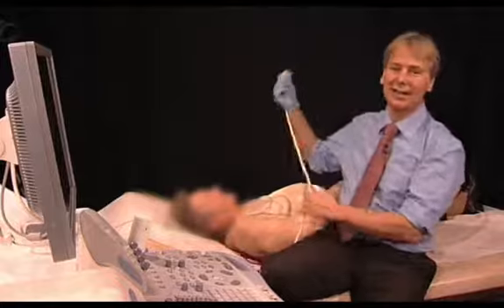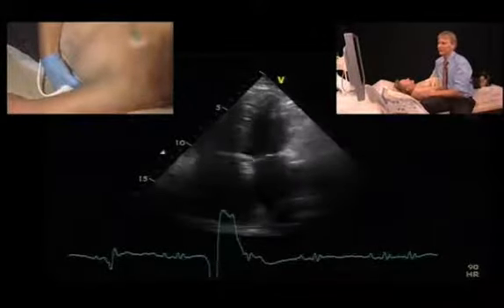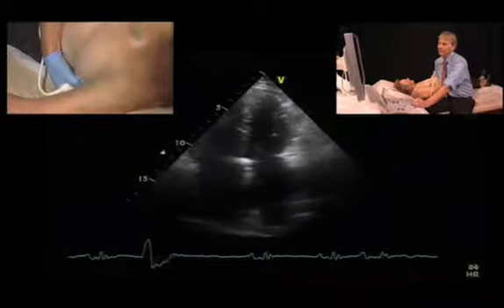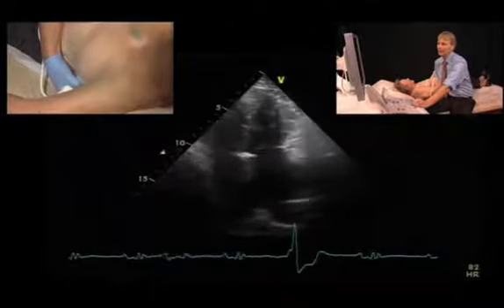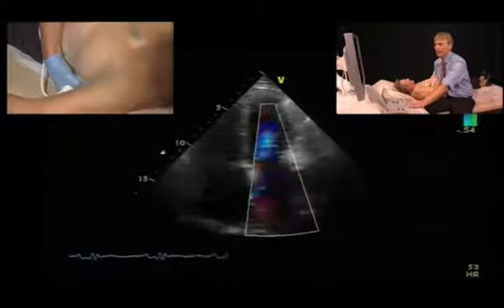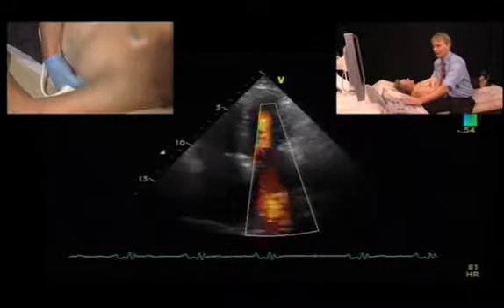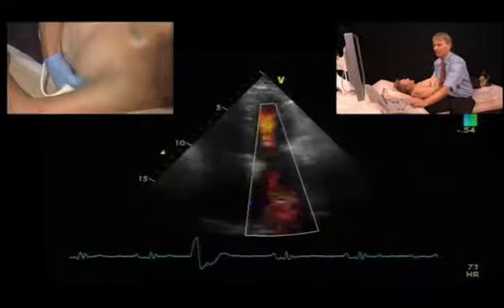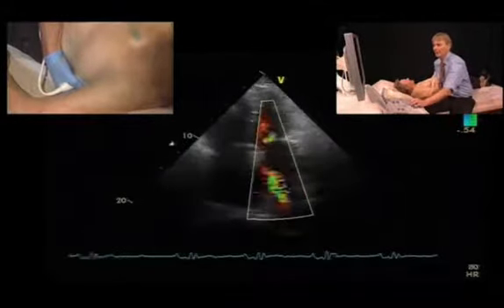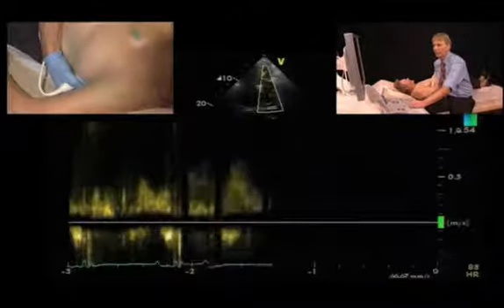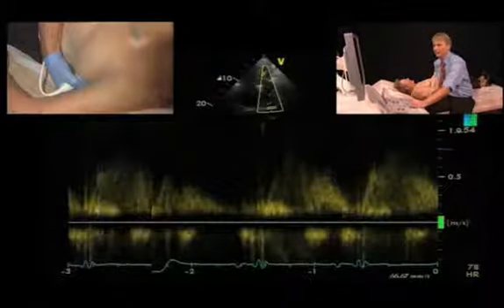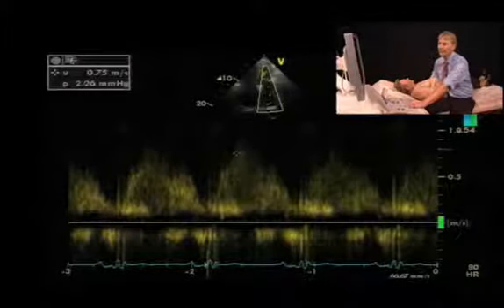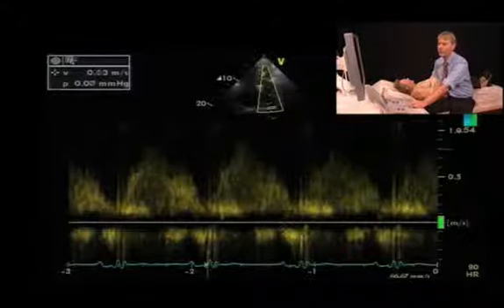Getting a good recording of the pulmonic vein is always a challenge. Starting from a four-chamber view, the first thing you need to do is try to see the pulmonic vein — we are looking for the right upper pulmonic vein. Then we use color Doppler and optimize the PRF settings, lowering them a bit so that we have turbulent flow, which helps us visualize the pulmonic veins. Then we place the pulsed-wave Doppler sample right at the pulmonic vein, going in as deep as possible. You will then get a signal showing the systolic component, the diastolic component, and the retrograde AR component in diastole.